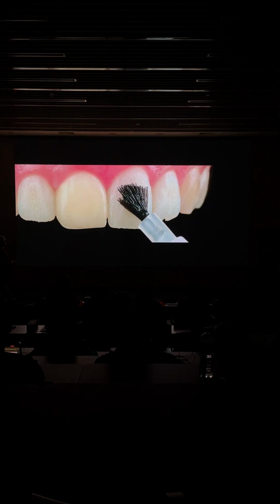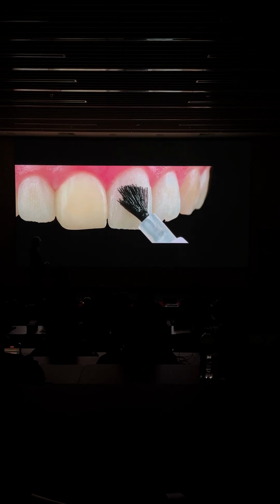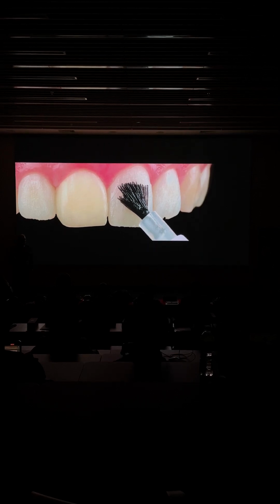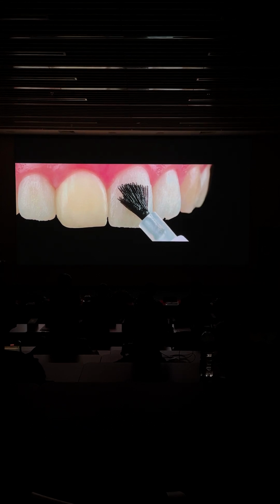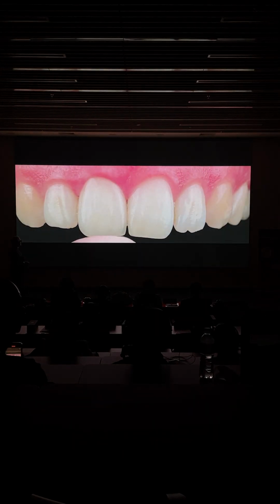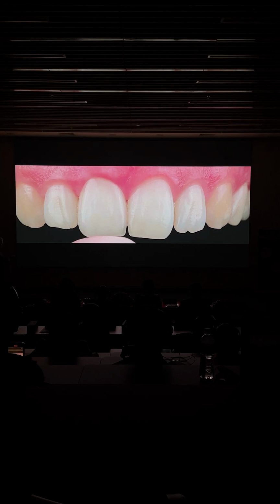And here, when you have patients that have bleaching, it's difficult to evaluate the value. So this is a trick we use a lot. We place Vaseline on top of the teeth, so we keep them moist. So this moisture stays longer, and we have a better vision of the situation and decide if the value is correct. You can see the contact points are from there.